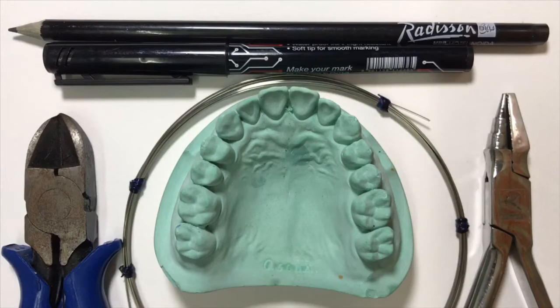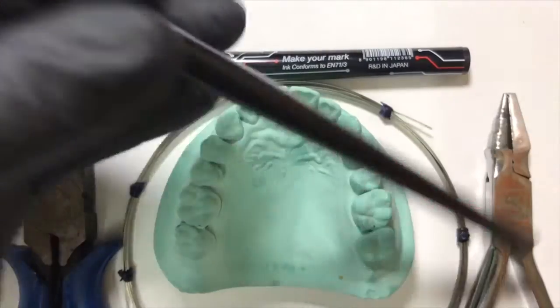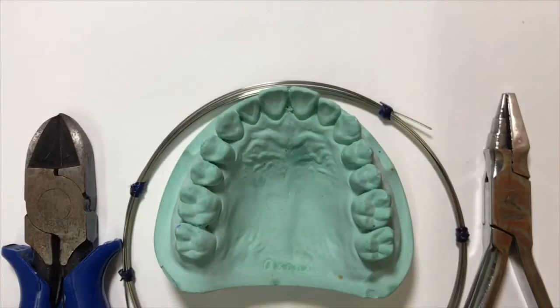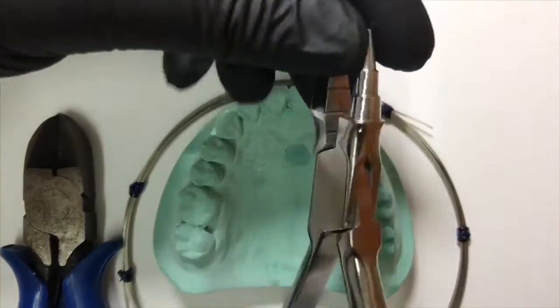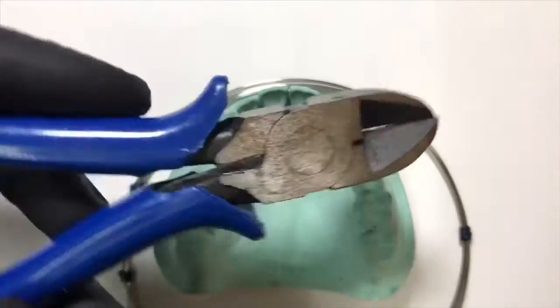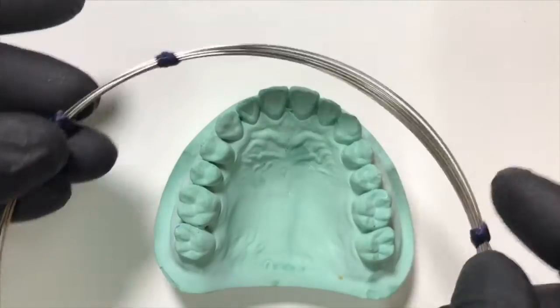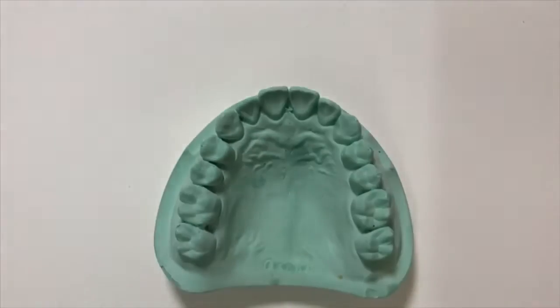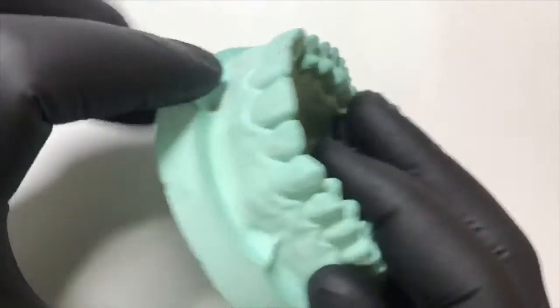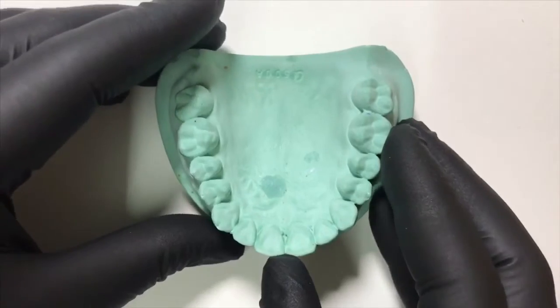For its fabrication we require a marking pencil, a marker pen, a universal plier, and a hard wire cutter. For its fabrication we use a 0.7 mm or 0.6 mm wire. We are going to learn on an ideal cast, specifically on the upper two-three. So let's begin.